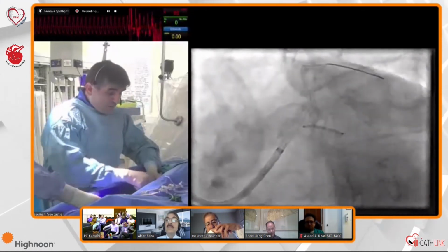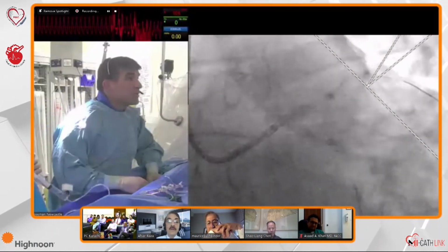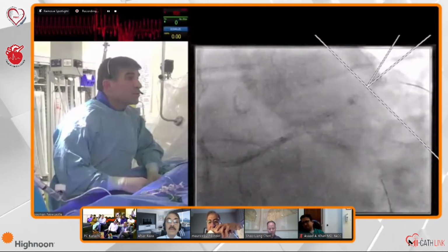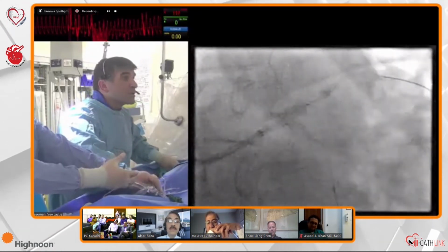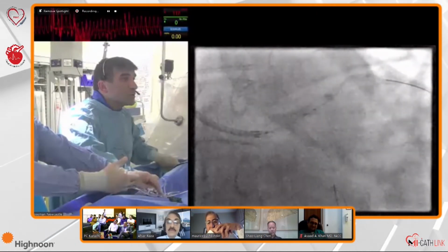Of course, you have to find the angulation, but if it's not, you could always use the IVUS, as I mentioned before. So I think it's a very brilliant way of avoiding the bifurcation, doing these complex and having to kiss and all the rest of it. But that doesn't mean you don't do it. So I'm going to just bring this back.